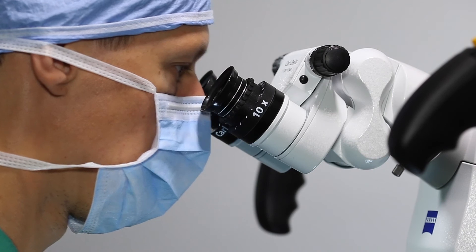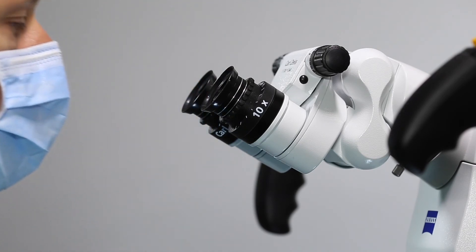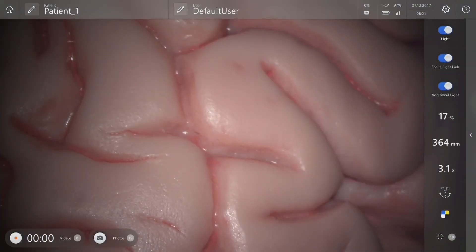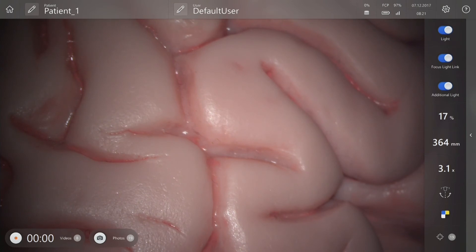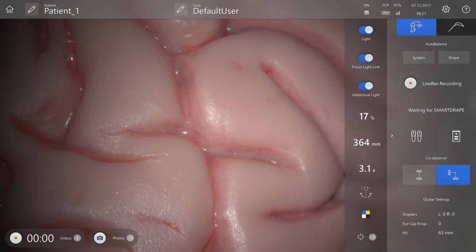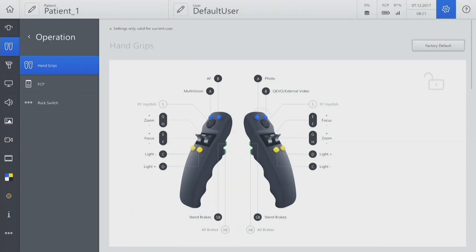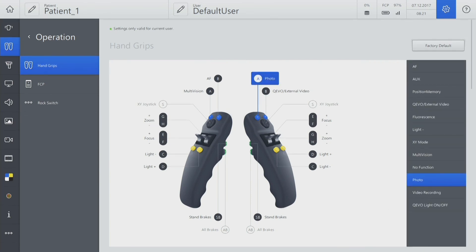If you need light in deep channels, you can use Zeiss Kivo as a light source only. To configure this function on the handgrip or foot control panel, open the respective icon from the main screen and go to Adjust settings. Configure one of the top blue buttons for the Kivo on-off light function.